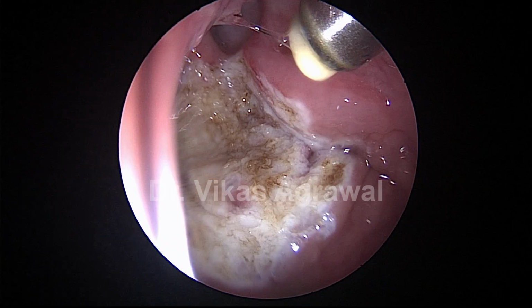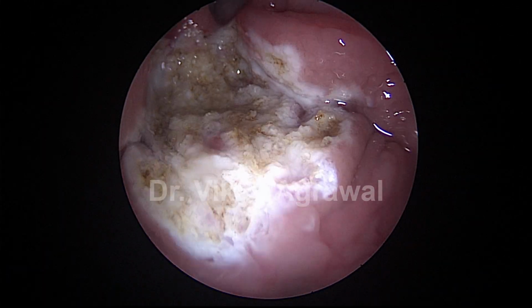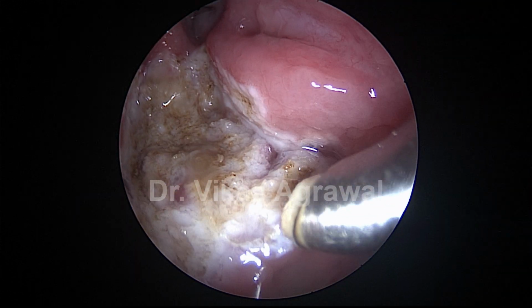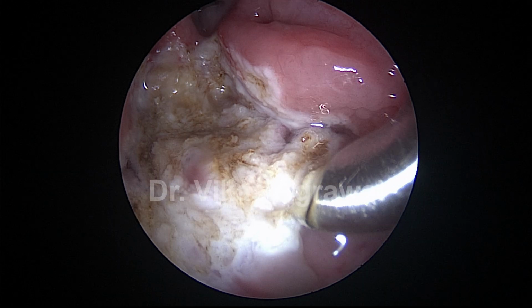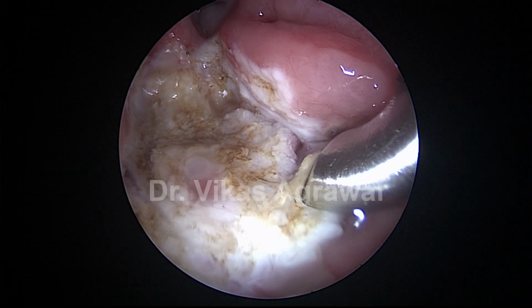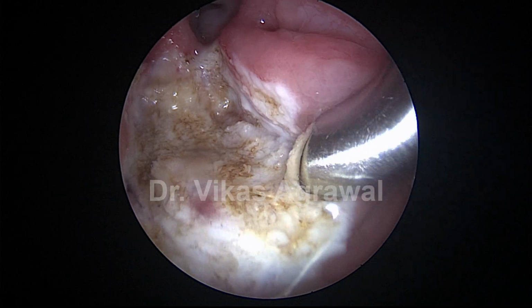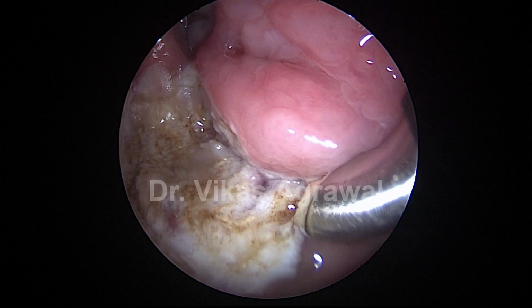So now let's see what is pending. There's a lot of tissue pending in the inferior aspect, near the Passavant's ridge, and behind the Torus tubarius.